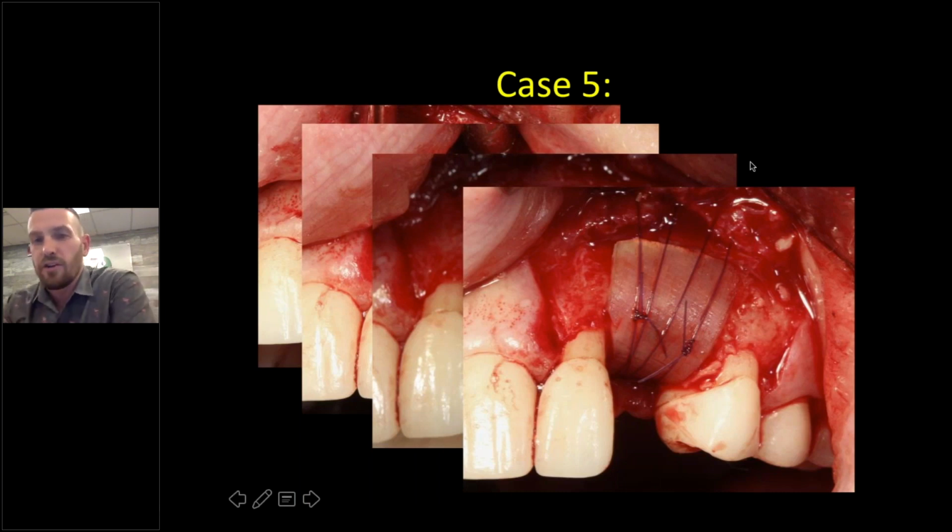What type of particulate allograft do you use, cortical, cancellous, or a blend? Typically, I use a blend. I tend to find that the inductivity and conductivity of utilizing this allograft is good with both. The cancellous gives us a nice open area for our cells to grow into, and then the cortical provides a little bit more structure for macrophages that are going to come in and turn all that bone over for them to kind of bite on, per se. I know that's not really a scientific answer, but truly that's why I like to use a blend.